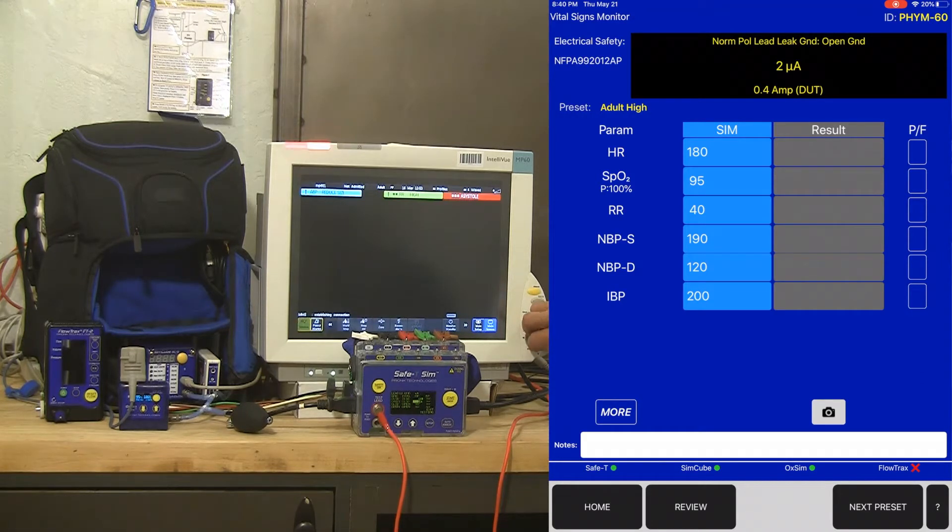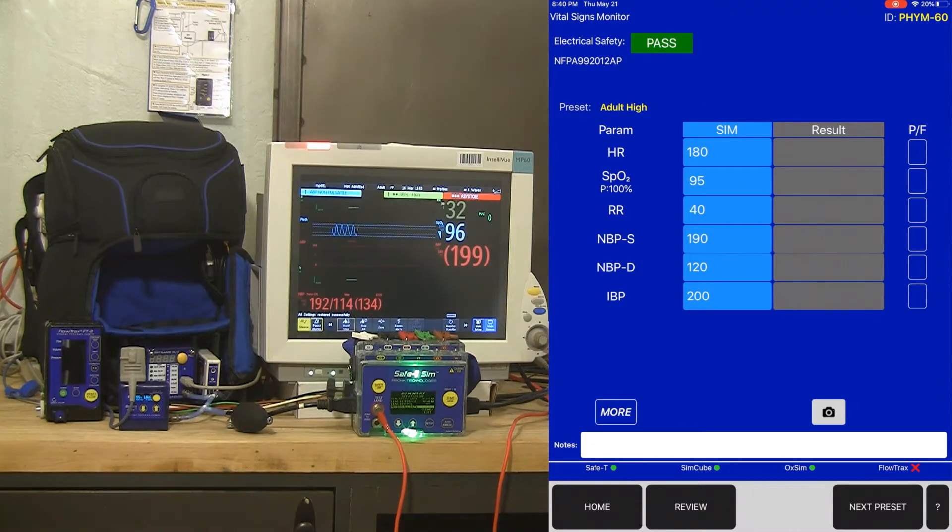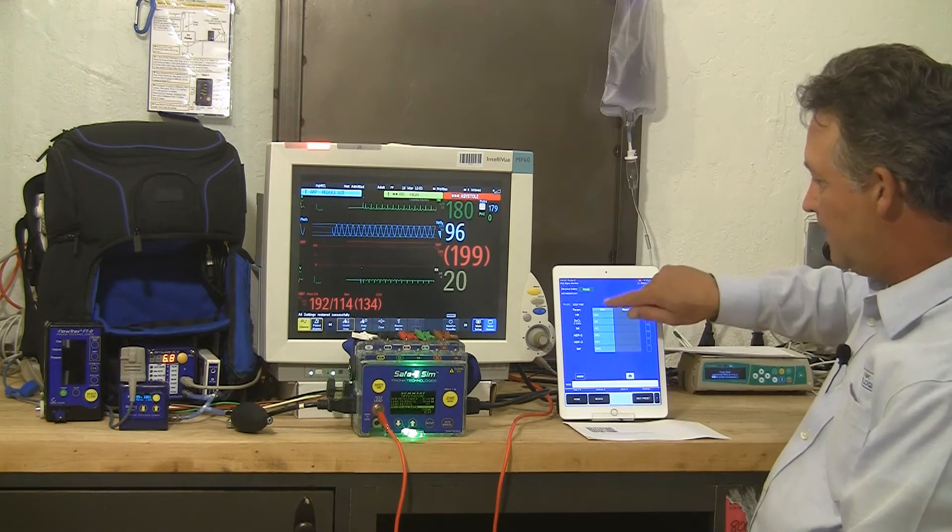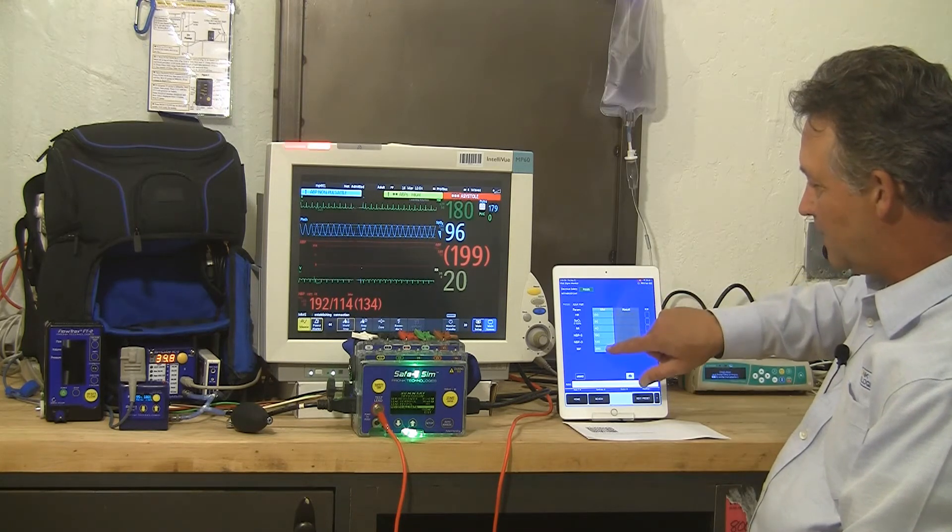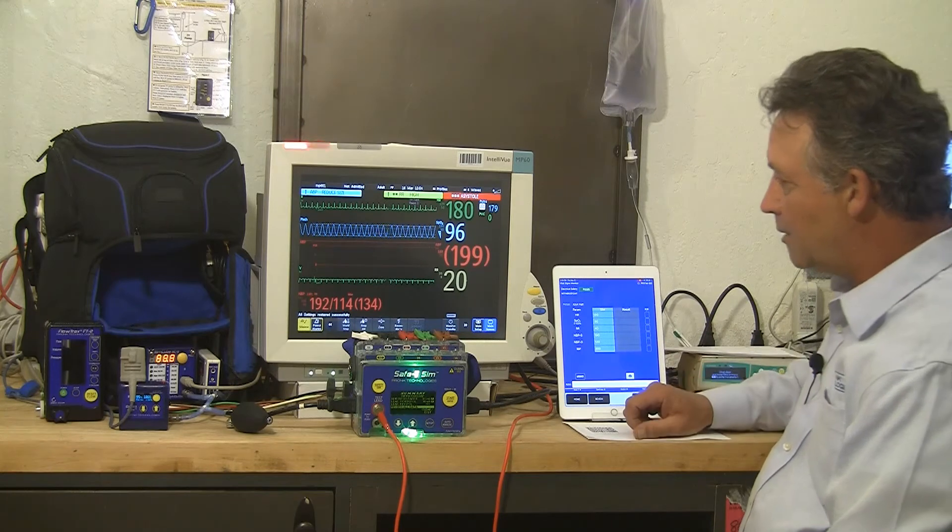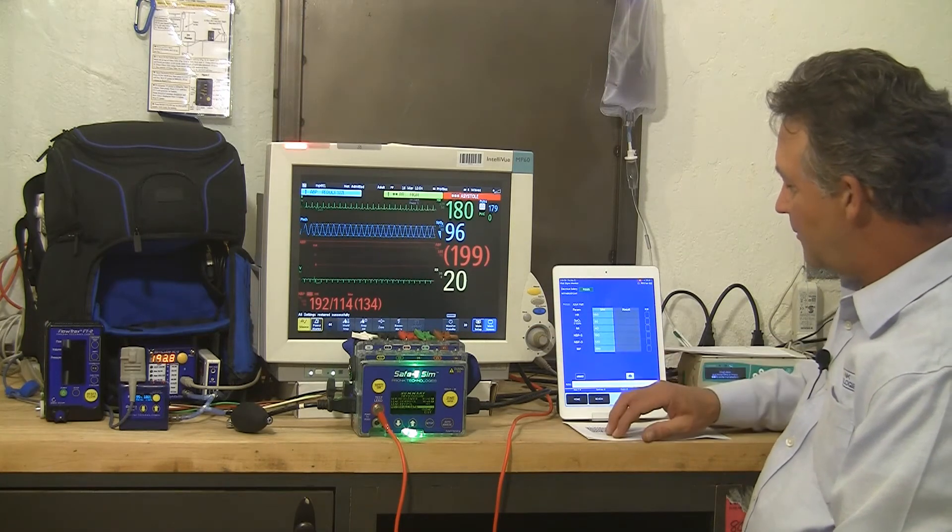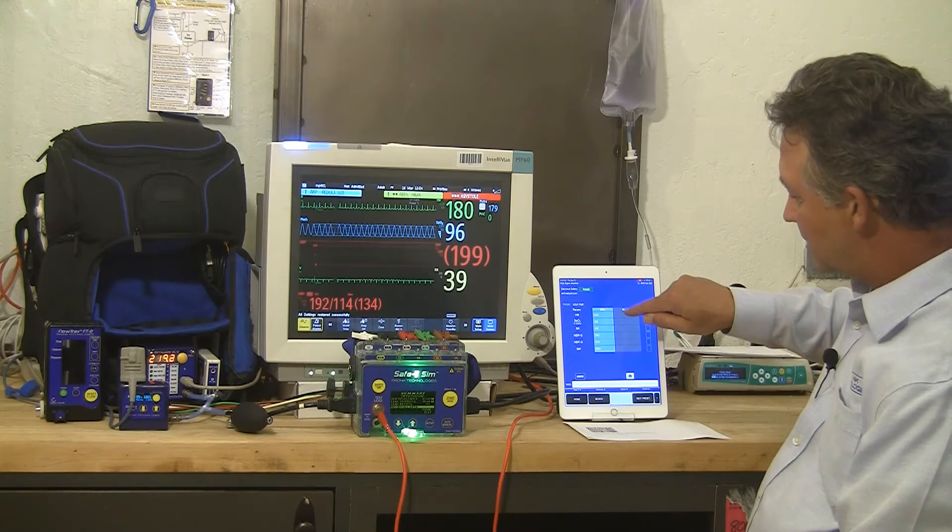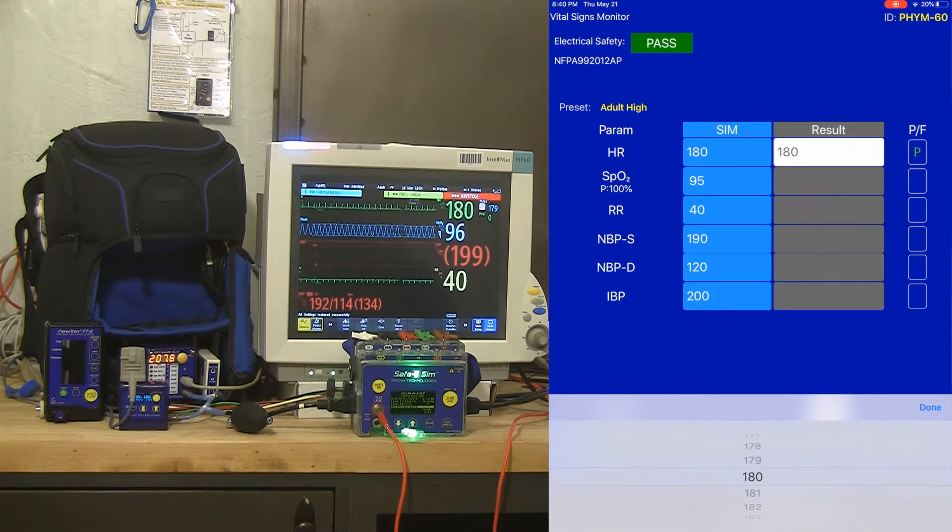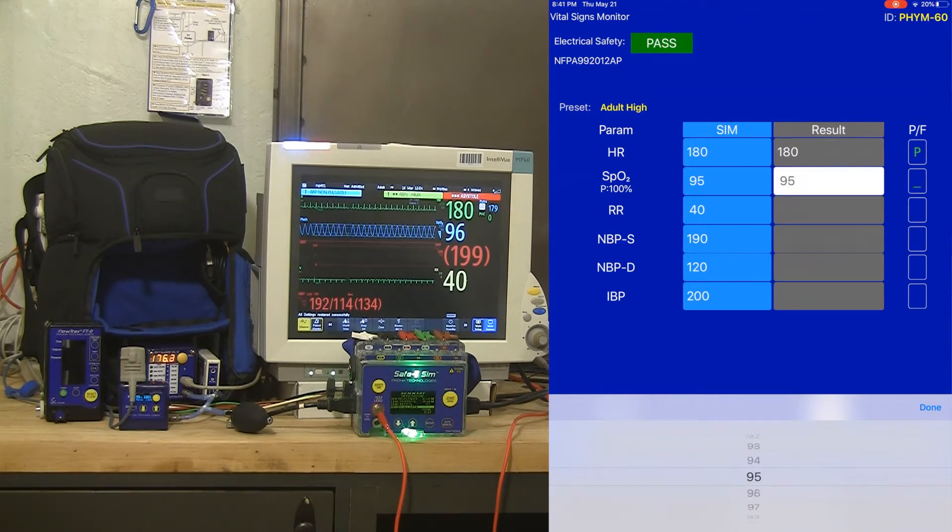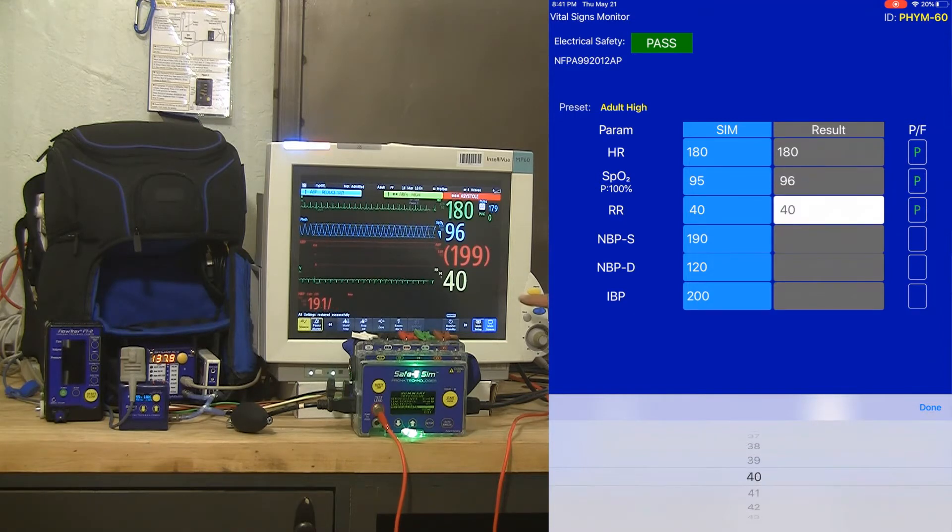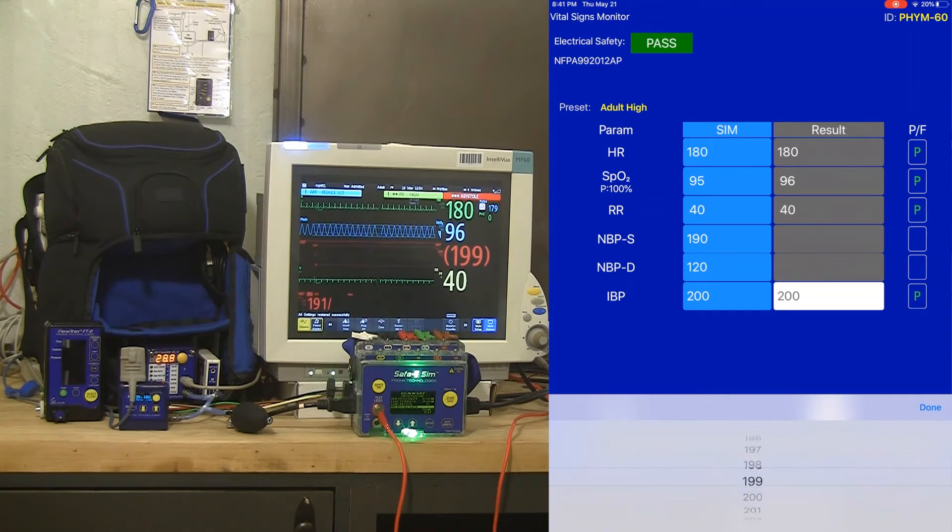As soon as the monitor powers up, I've got a pass for electrical safety already, and I can hit start on the NIBP. On the left-hand side of this screen, you'll see the simulated values. On the right side is where you can populate the results. I'm starting the NIBP right away because while that's taking a measurement, I can tap on the results box and capture my heart rate result. That's a pass. My SPO2 target is 95, result is 96. My resp rate target is 40, result is 40. Invasive pressure 199.